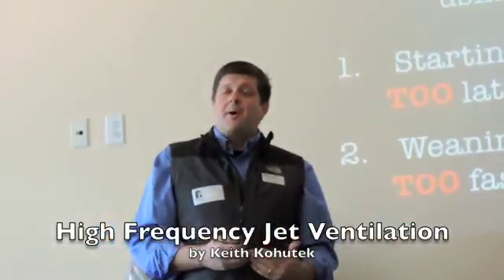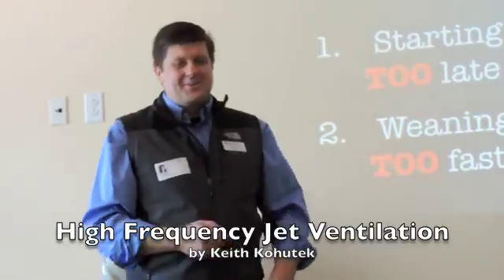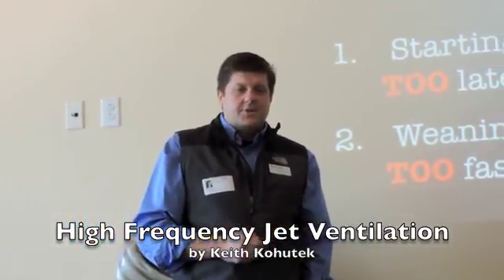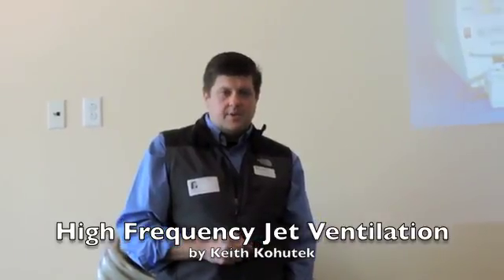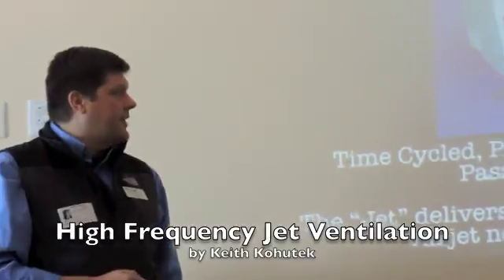And then the only thought in our mind is getting them off the ventilator that's actually working. I've never really understood that. And what we can do is take the ventilator here, take the jet straight to extubation, and we don't need to hastily get off of it and go to conventional ventilation.